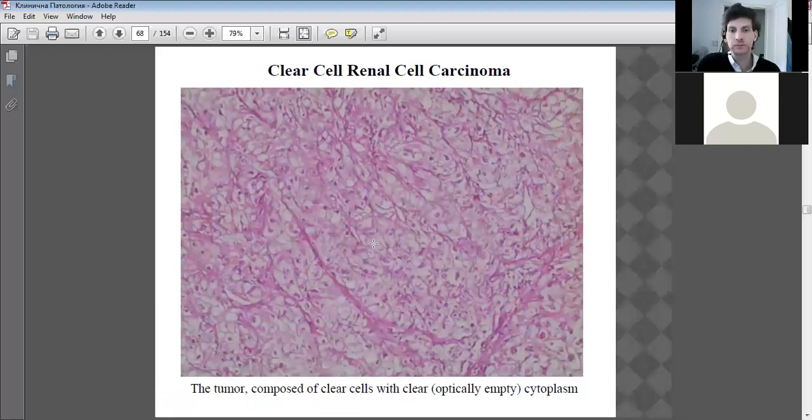The carcinoma, again, as we can see, massive abnormal cell division. Empty or clear cytoplasm, as I said before, the cells of the tumor derive their nutrients from the normal healthy tissue outside its mass. What a tumor does have, though, is a lot of blood supply to it in order to gain those nutrients. So if we did another slide or stain, we could probably see quite a lot of the blood vessels. Not so clear here in this particular H&E section.